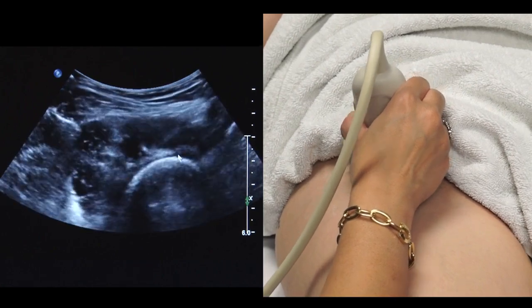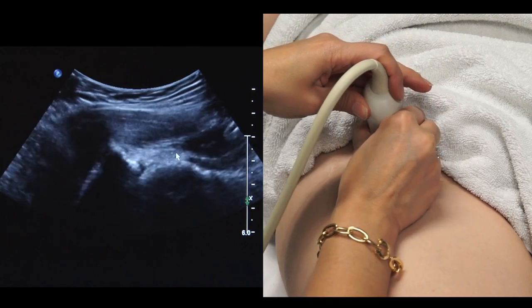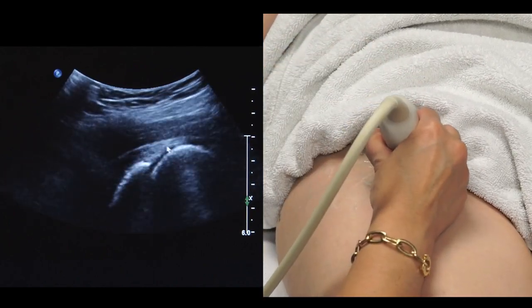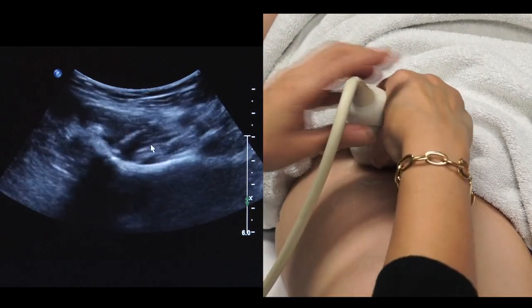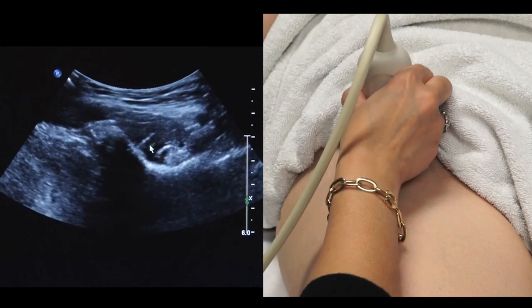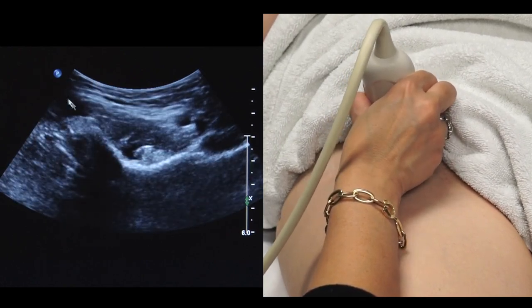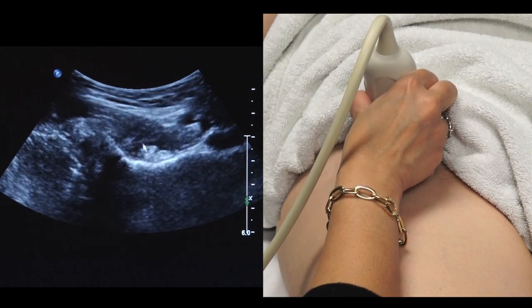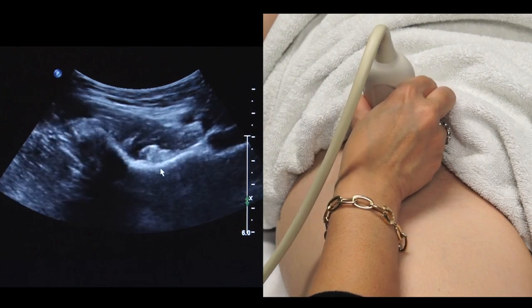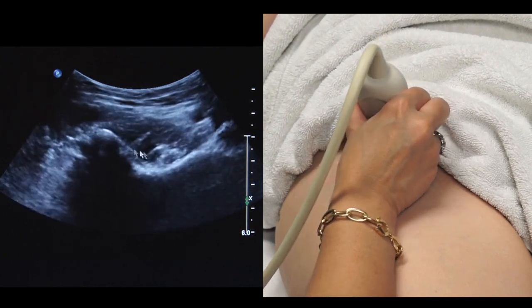And you can scan that tendon in transverse. You can also turn on it to see it in long view right here. But if you plan to do an intervention, if you want to inject into the iliopsoas bursa, this would be a good view. You can come in from a lateral to medial approach as the bursa sits and communicates just deep to the tendon. We don't see it right now because it's not distended with fluid.